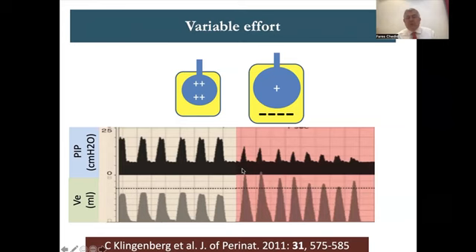Now, what's happening? The patient wakes up and starts doing huge efforts. While he's doing this effort, the machine starts to do less pressure because his volume was above the volume guarantee, all the time. So the machine was doing less and less PIP. And at some stage, as I showed you before, because the volume was exceeding 130% of the volume guarantee, the pressure was interrupted, and the graph became triangular. There was a dump of pressure. The graph, which was rectangular, became triangular.